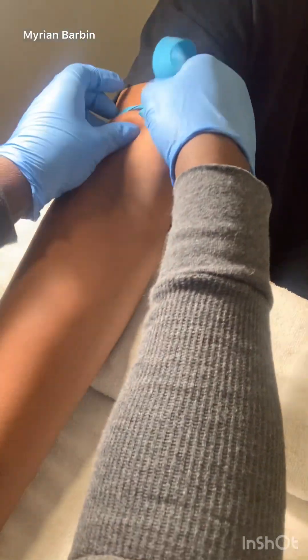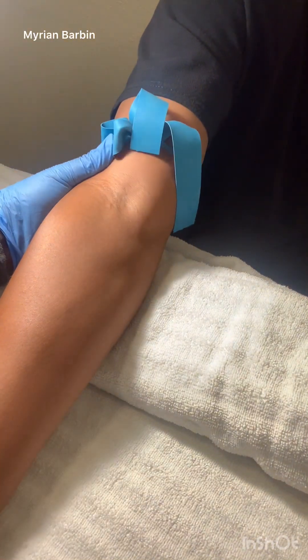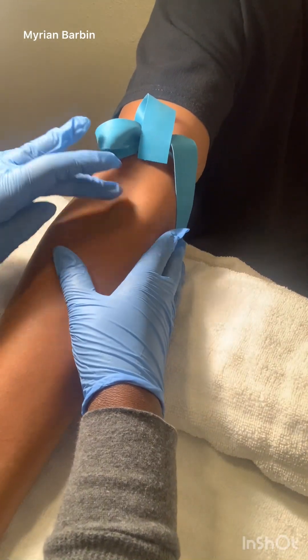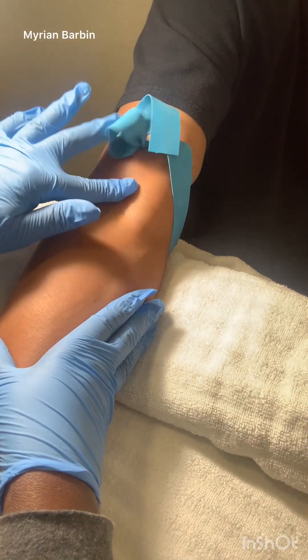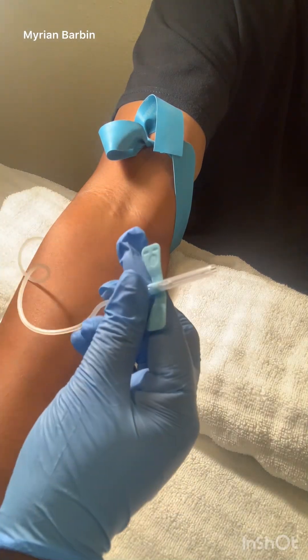Make sure that you put your tourniquet on nice and tight, but make sure it is comfortable for the patient. Position the patient's arm so that you can see the vein. Keep tapping and poking and thumping until you see a good vein pop up.